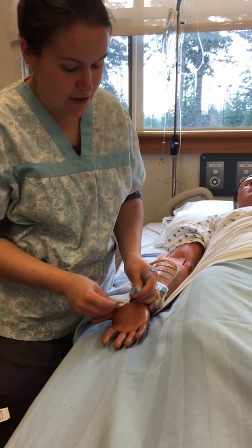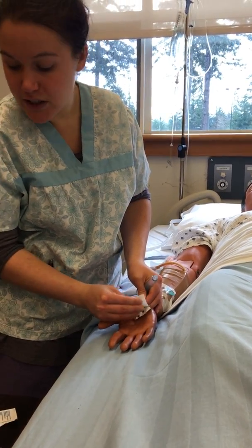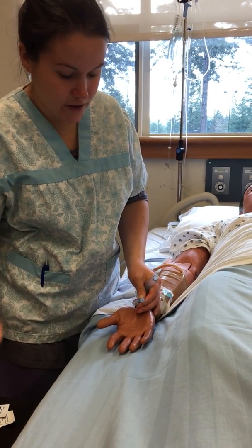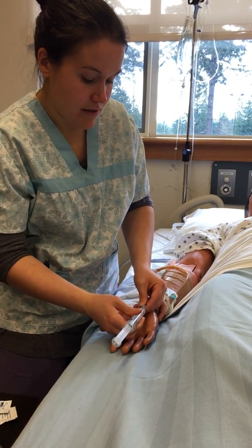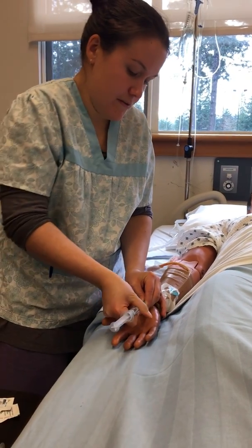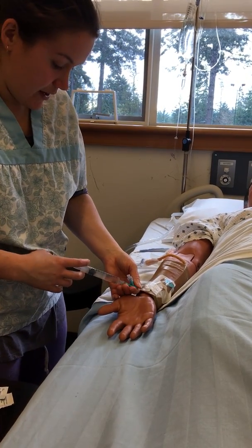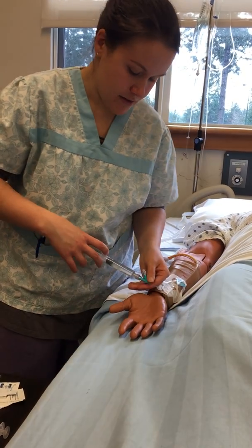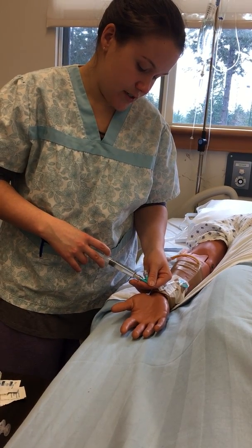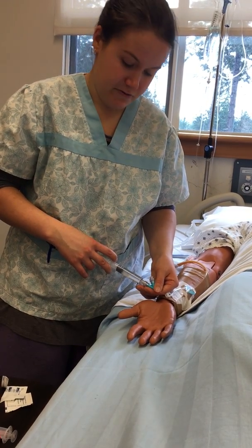So I've got this open, I'm using a no-touch technique, making sure not to touch that. Clean this for 15 seconds. Good. Then I'm going to attach this. And then unclamp this, very slowly push it the first 2 mils over the course of 1 full minute.